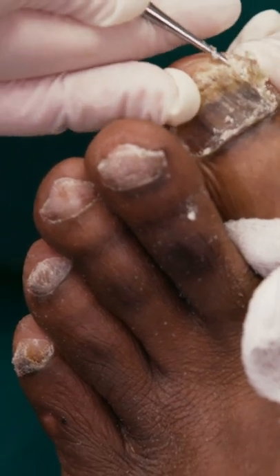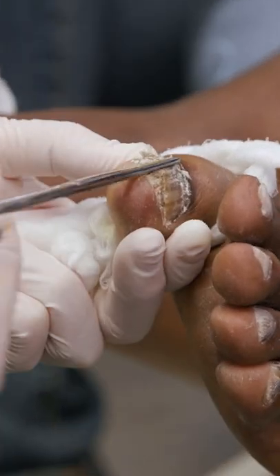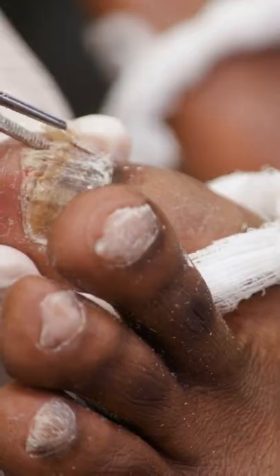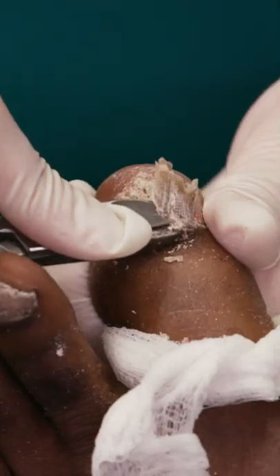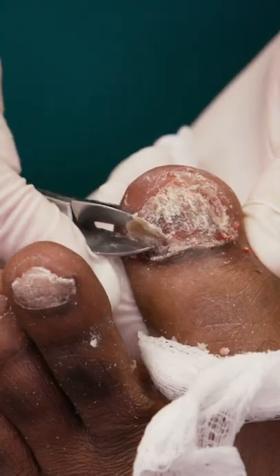I go to take off the nail plate on the left, and it's just monstrous. It's coming off in shards, and they're sharp and brittle at the same time. It's all because of the fungus — it's super infected.